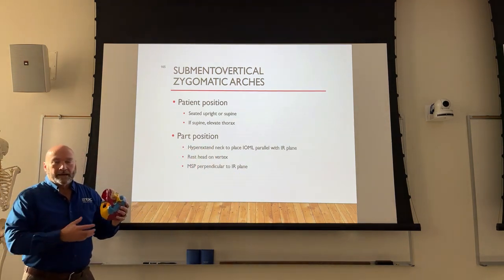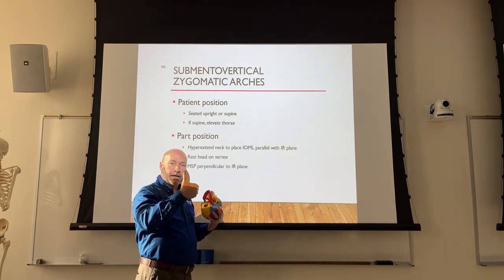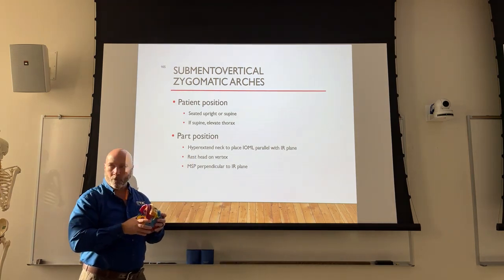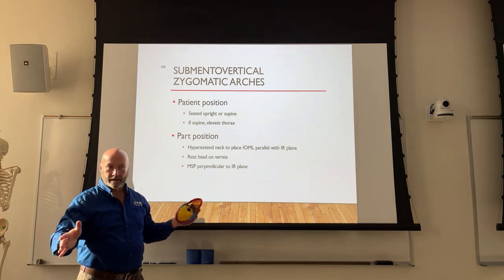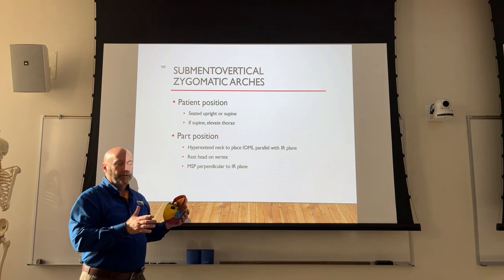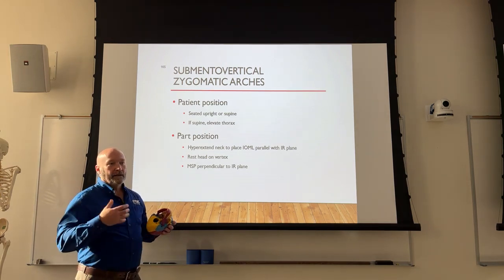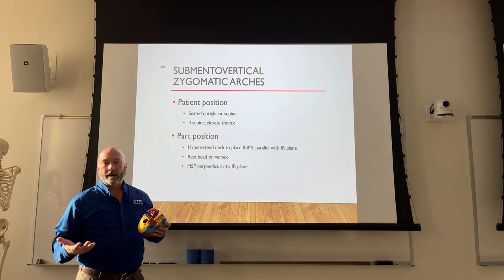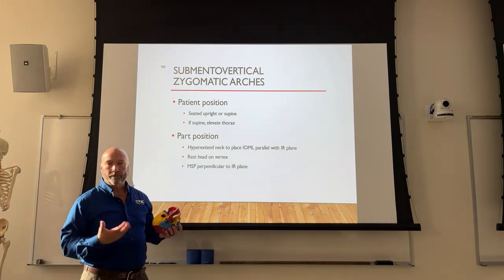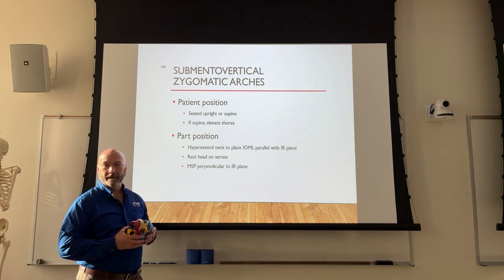So how you apply that is that if you need to see both zygomatic arches, if you reduce your SID, then naturally you're going to have a wider divergence. Does that make sense? So instead of shooting it 40 inches, reduce it to 30 inches or something like that, if your machine will allow it. Sometimes on the wall bucky, it won't allow it. So how could you get past that? Any idea?